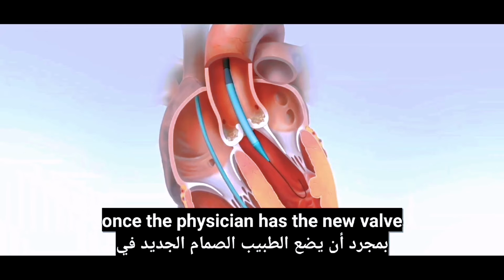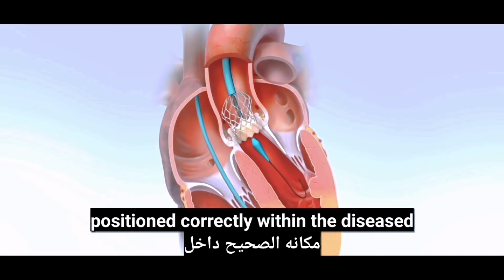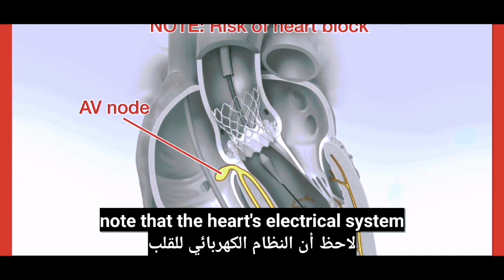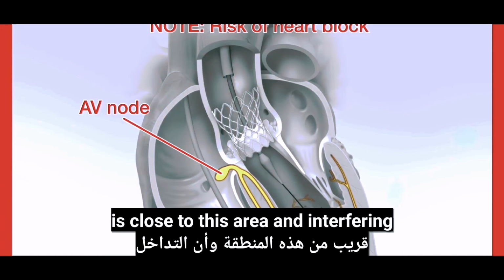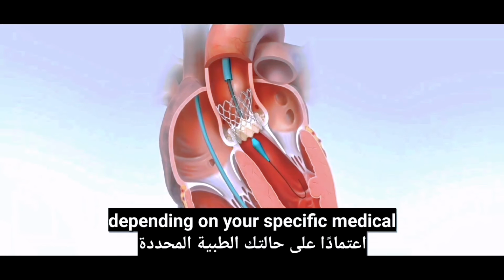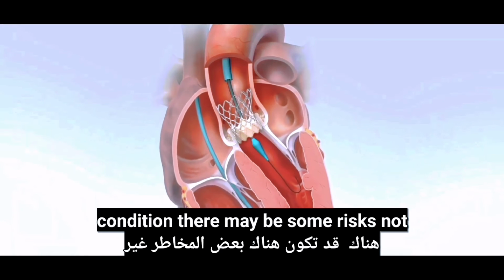Once the physician has the new valve positioned correctly within the diseased valve, the heart is paced. Note that the heart's electrical system is close to this area, and interfering with normal beating of the heart is a risk. Depending on your specific medical condition, there may be some risks not listed here.